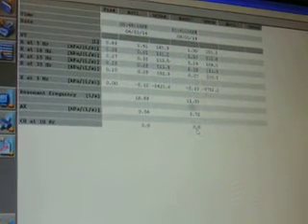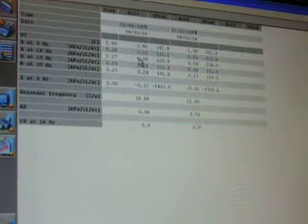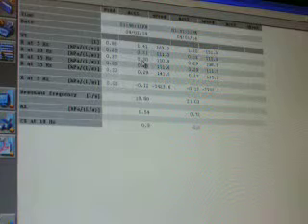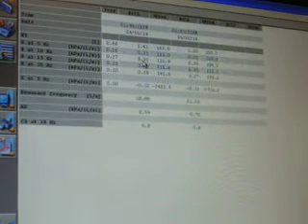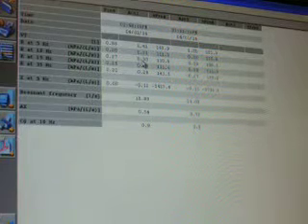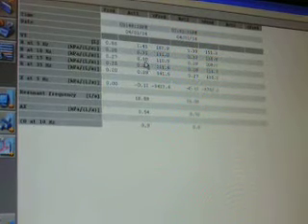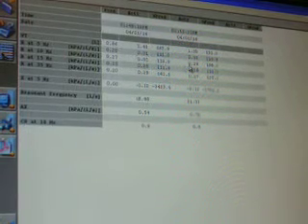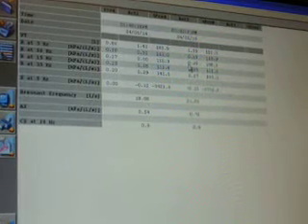To look at repeatability, I want you to look at the R at 10 Hertz and see if the 3 maneuvers that you're accepting are within 20% of each other. This one is 0.3 kilopascals per liter per second, so it's 0.3, and 0.29, well within 20%.